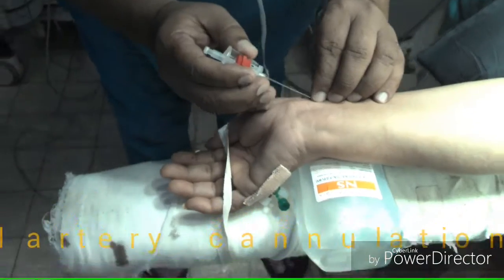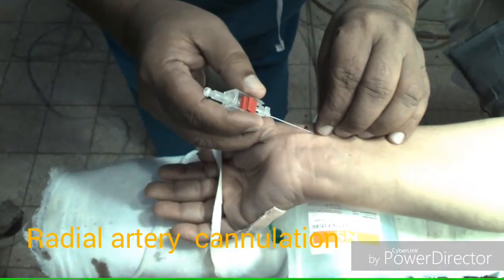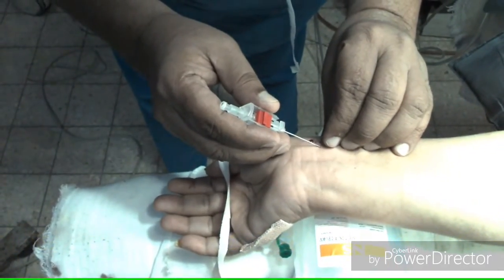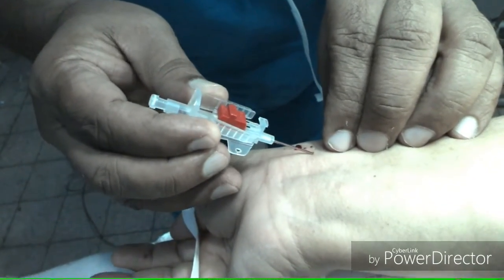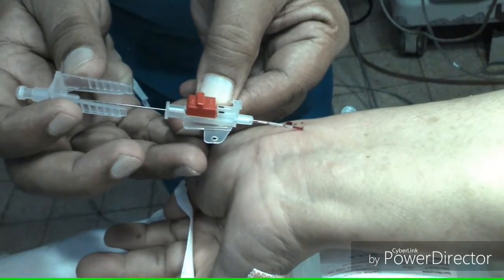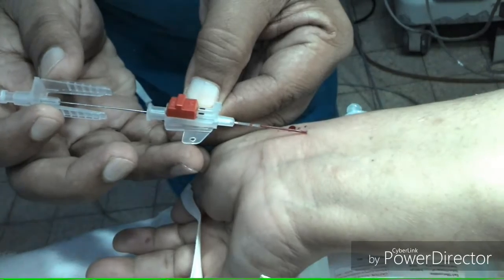We can cannulate the radial artery, dorsalis pedis artery, femoral artery, ulnar artery, or brachial artery, but most commonly radial artery cannulation is done. Before cannulation of the radial artery, we must do Allen's test to assess patency of the ulnar artery, especially in older patients.